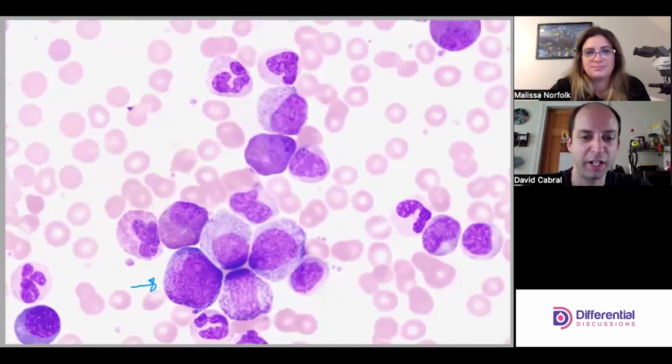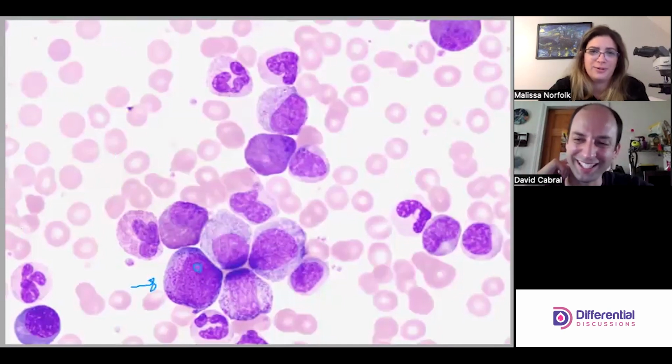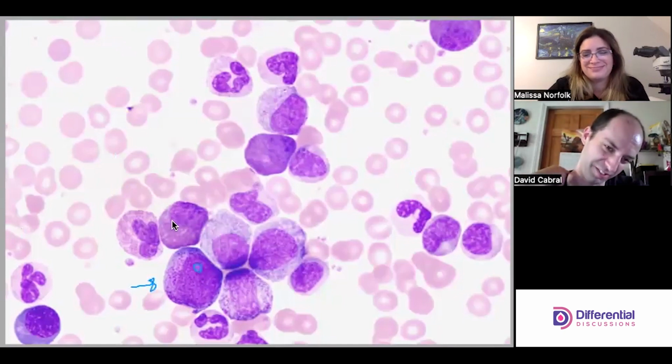You have primary granules. You see them presenting on top of the nucleus. The nucleus has kind of a fine texture to it, owing to its general relative immaturity. You've got a nucleoli there. Great cell, sort of. Well, he's a beautiful cell, but he's still a beautiful cell.